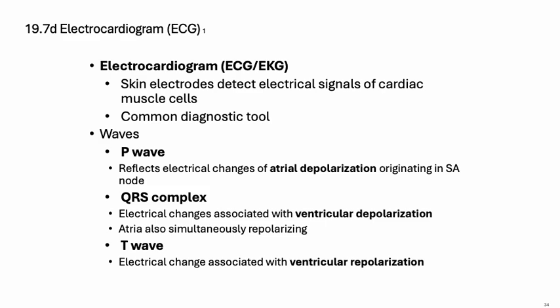This is a clinical tool that's used to visualize the electrical activity of the heart. So we're detecting the electrical signals of the cardiac muscle cells, and this can be used to identify various heart abnormalities, or different heart abnormalities can be reflected in an EKG.